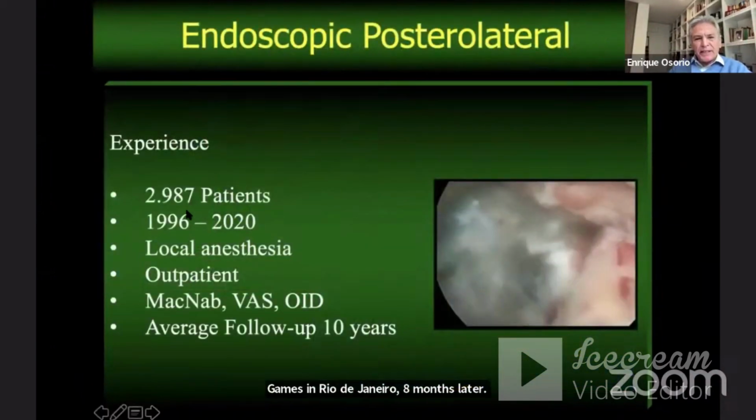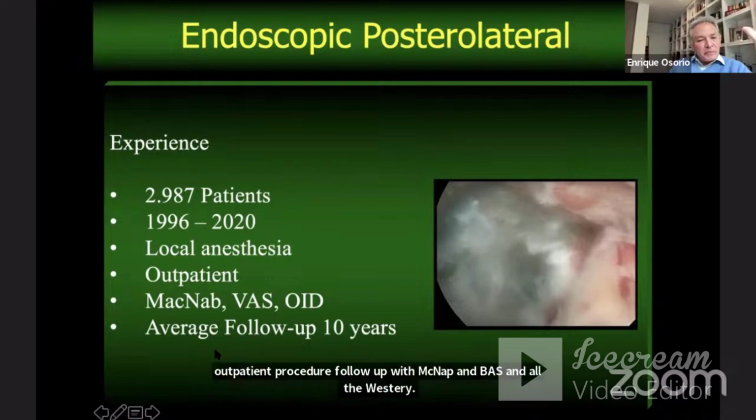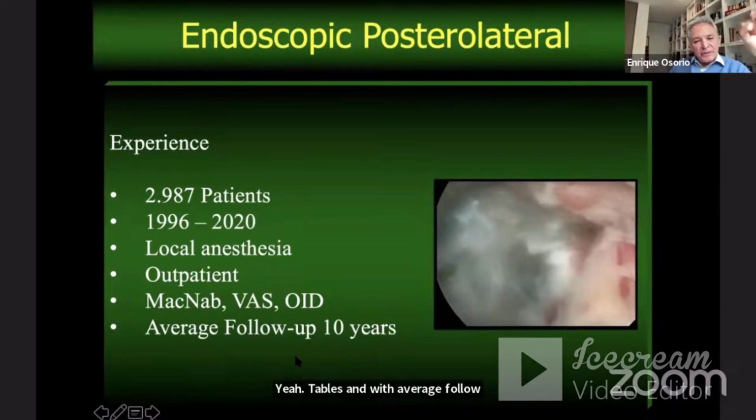In our experience, in nearly 3,000 patients between 1996 and 2020, under local anesthesia, as an outpatient procedure, we follow up with the McNab, VAS, and Oswestry tables, with an average follow-up of 10 years.